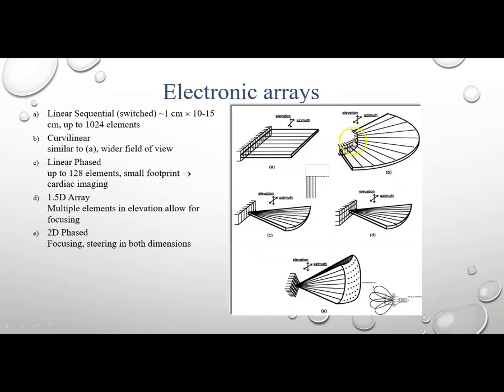So you see the curvilinear up here. So linear array, curvilinear array. This is a phased array sector transducer. The beam comes out in a sector shape. This is a phased array and something called a 1.5 dimensional array transducer, and I'm going to get into what that is in just a second. But again, it's a sector array transducer. This is a two-dimensional array transducer that's forming a sector. So let's go into what this 1.5 dimensional array transducer is, because that seems important to some people.